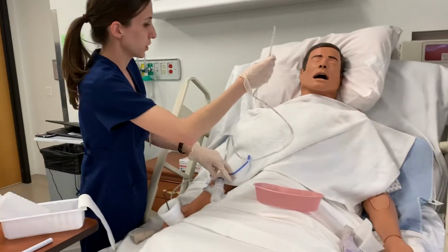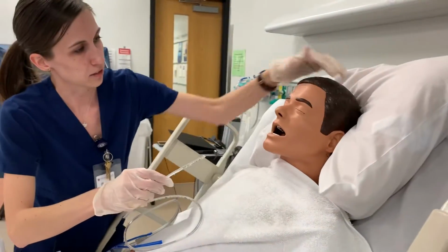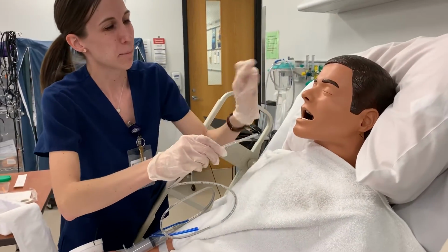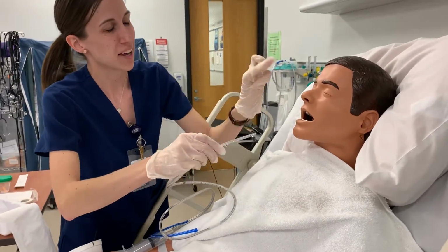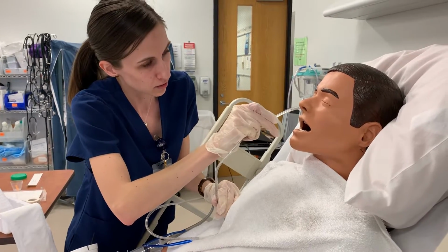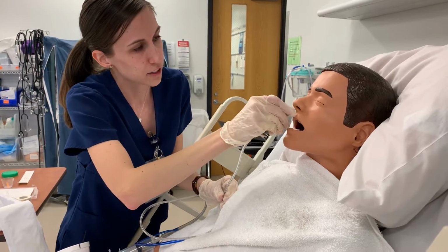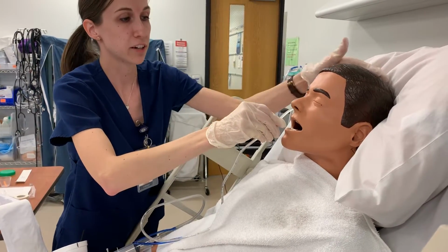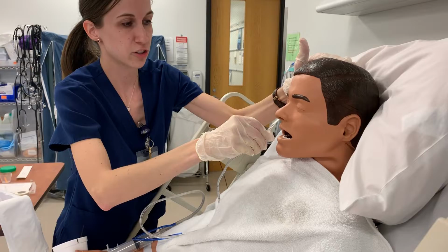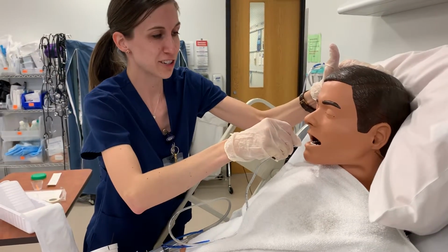Okay, and then what I'm going to be doing now is that I'm going to again be aiming back and down towards your ear. I have my syringe attached. I'm going to be inserting again into the nostril closest to me. So I've inserted. Once I pass that nasal pharynx, I'm going to ask them to bring their head down, so their chin to their chest. The mannequin won't stay in that position, but we're going to say that their head is chin to chest.